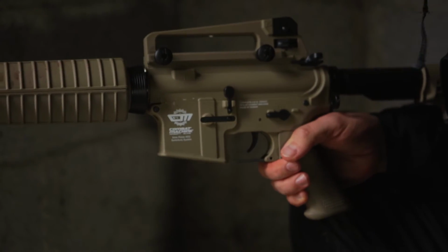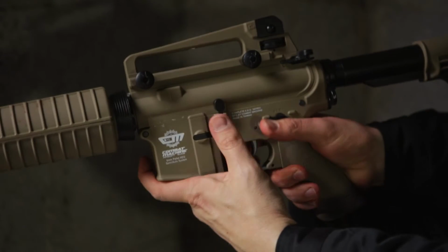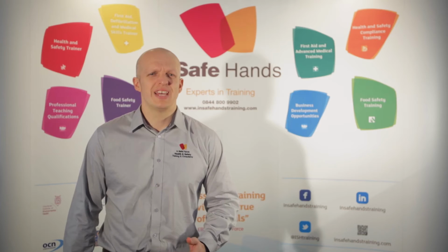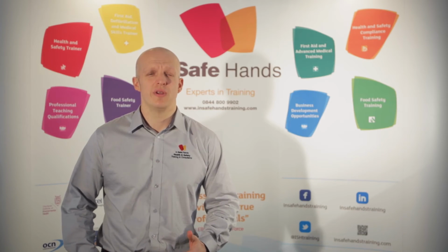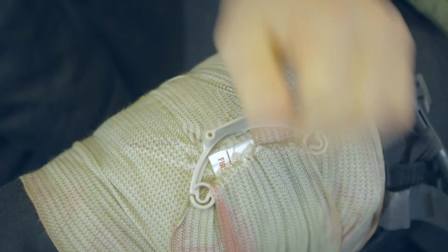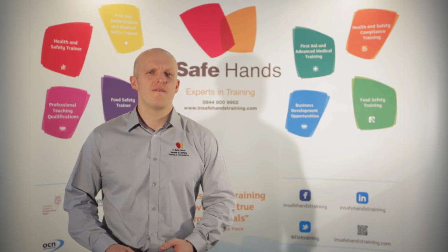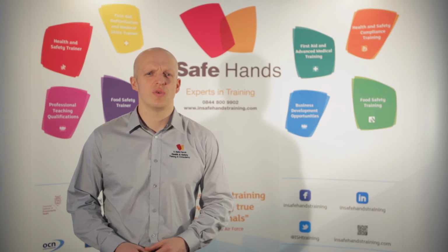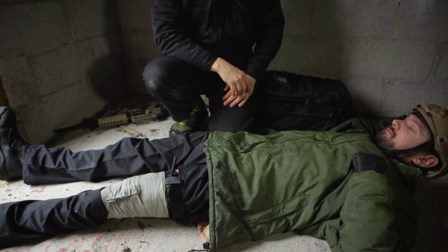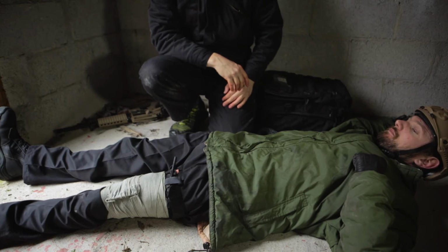Emergency bandages have been designed to provide active compression upon a wound site. They are significantly more effective than normal first aid at work bandages. They're designed such that with a plastic ratchet we can apply further existing pressure directly to the wound site. If an effective tourniquet has been placed and a hemostatic agent used, the chances of bleed through on these bandages should be minimal.